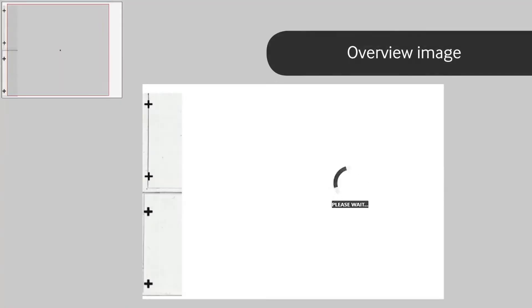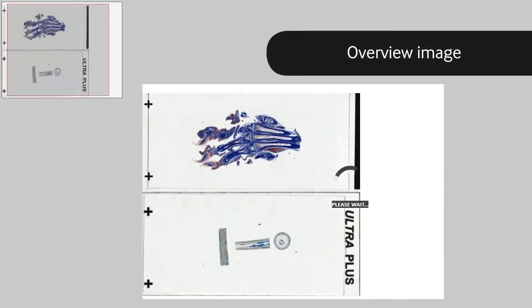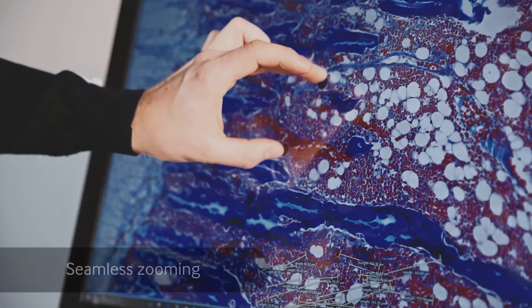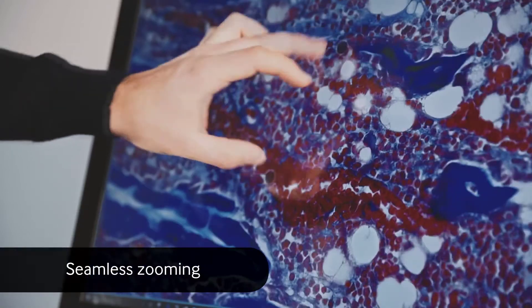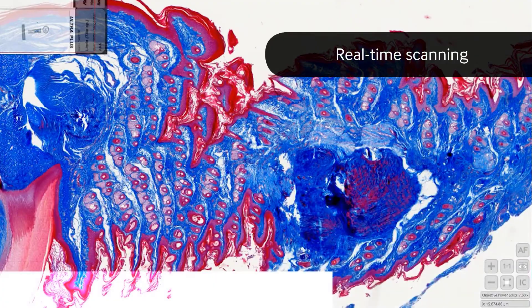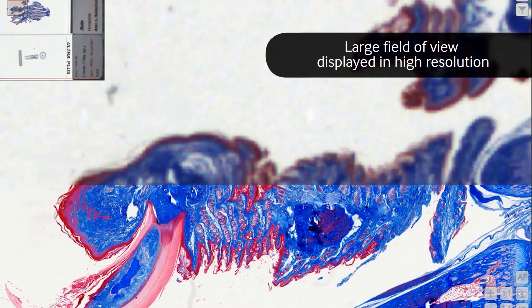With the generated overview image, you seamlessly zoom into your sample. As you navigate through the slide, the sample is scanned in real-time, resulting in a large field of view.